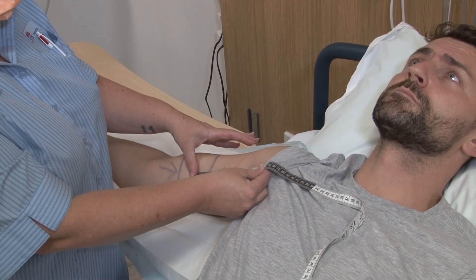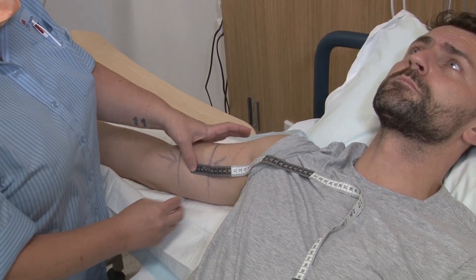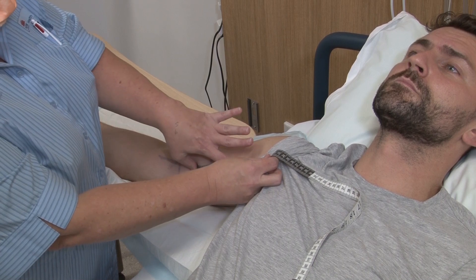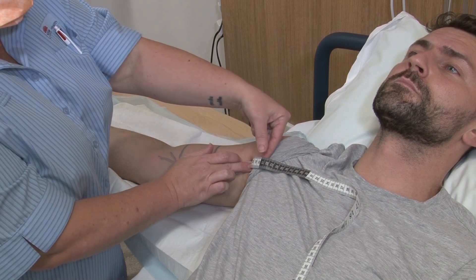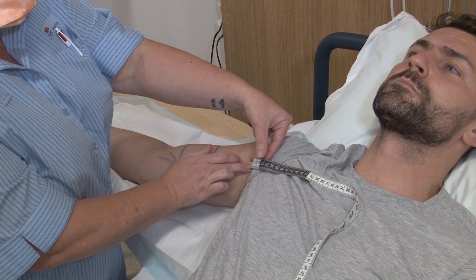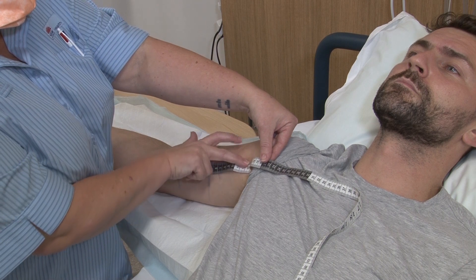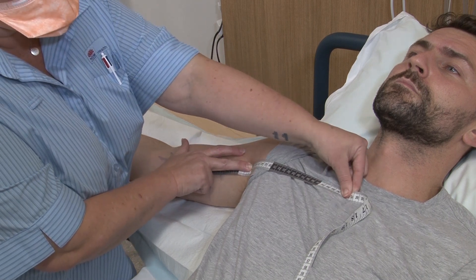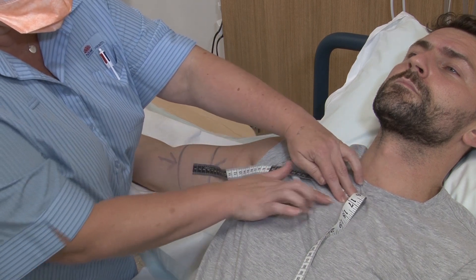Measuring the patient for internal PICC length can be performed by beginning at the intended insertion site, tracking up the shoulder, across to the sternal notch, then palpating down to the third or fourth intercostal space.